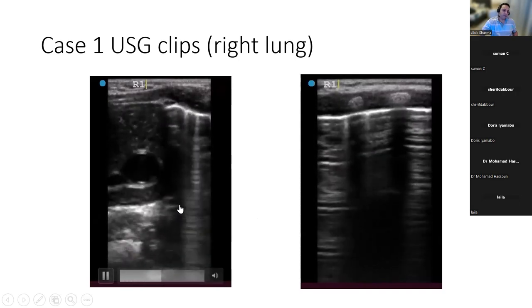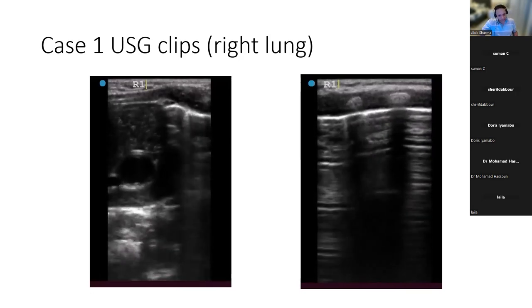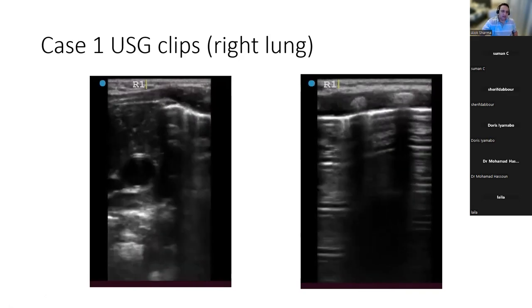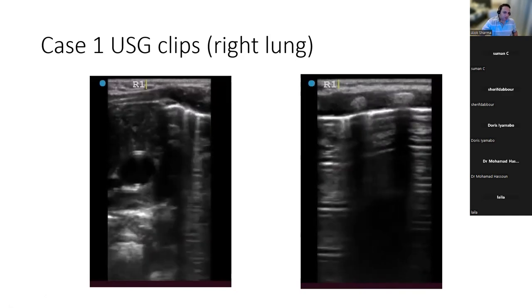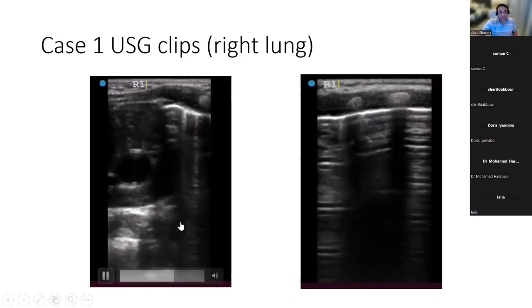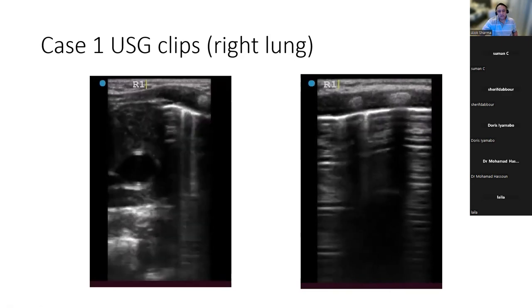Absolutely, you've got thymus in there. Don't worry, because you're high up. Whenever you're high up, and this is a very important image to get, you will often get thymus there. It just means you've got the upper lobe really nicely. From what I can see in the right upper lobe, you've got an AB profile. You've definitely got B lines there, and you've got pleura that's definitely sliding, maybe a little bit of pulse there, possibly because of the adjacent vessel.